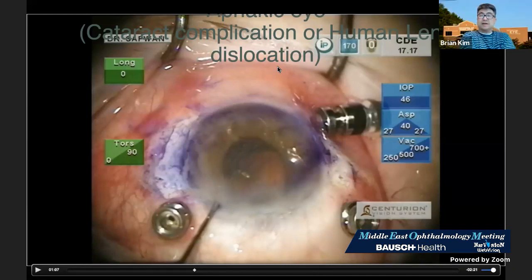What is your opinion regarding the four-flanged technique, in a very short answer? Yeah, I think it's great. The popularization of using 5-0 Prolene to create a flange and passing it around, lassoing around the lens and haptics, is excellent. I've been a fan of using Gore-Tex to secure lenses for repositioning, but I think using the 5-0 Prolene to do the same thing without conjunctival dissection is basically like Yamane, but instead of the haptic, you're using suture. And the criticism has always been with polypropylene that they break, but with the 5-0 Prolene, you can create the flange just the same. Very efficient. I'm looking forward to trying it, but I haven't done it yet.